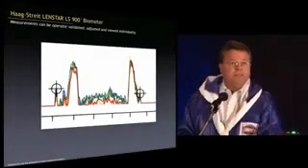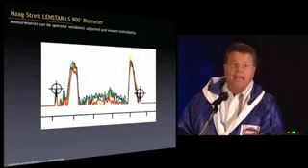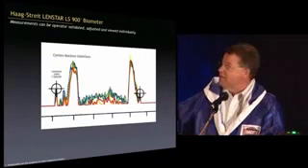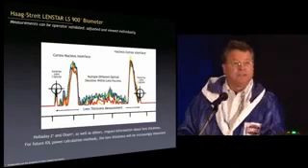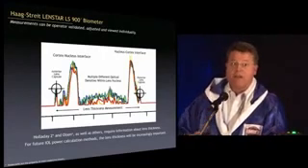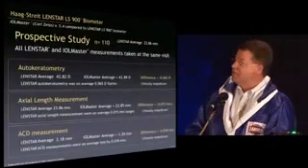Now, one amazing piece of technology is that not only you get the lens thickness, but you actually get to view the internal anatomy of the lens. So you have the anterior lens capsule, the nuclear cortex interface, all the different things going on within the nucleus, and the posterior lens capsule. We're talking about clear structures here that are either 12 microns thick for the anterior capsule or 5 microns thick for the posterior capsule. It is actually able to image those.